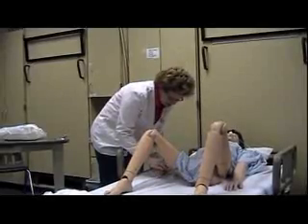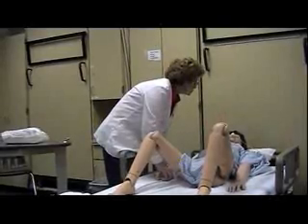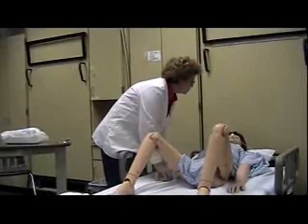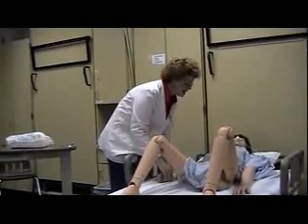Check the name band — Mary Larson. Are you allergic to iodine or shellfish? How about latex? No? Ok, good. I will double check your allergy band. It does not say that you have those allergies.